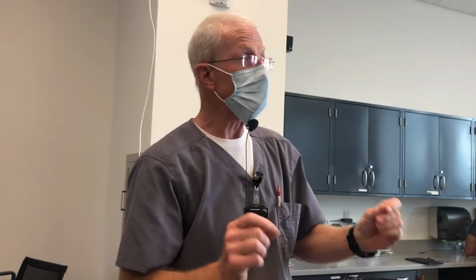And so if that were to happen, what do you do? The cement's too viscous, you realize it, you've inserted it, it's not seating all the way, what are you gonna do? Abort! Get it off and get it off quickly or you won't get it off. And then it's really a pain because you gotta clean off the tooth well, you gotta clean out the inside well, the intaglio. Try it in again, make sure there's no little chunks of cement anywhere that are gonna interfere, and then go through the process again. But if it's not going down all the way, just stop, back up, take it off. Don't try to push it into place because it won't go.